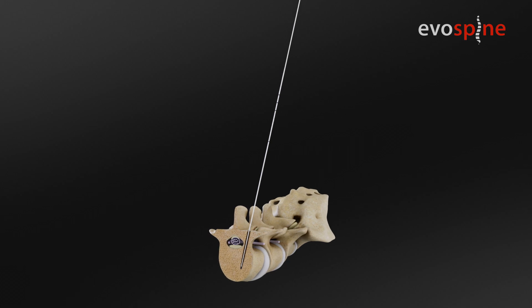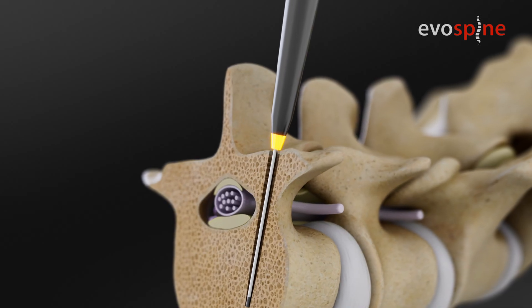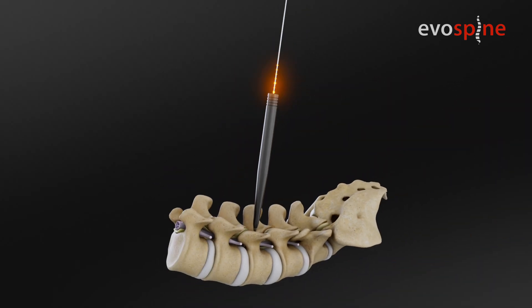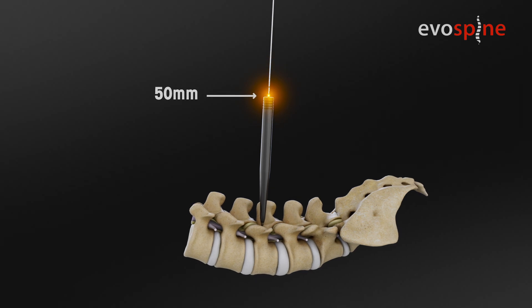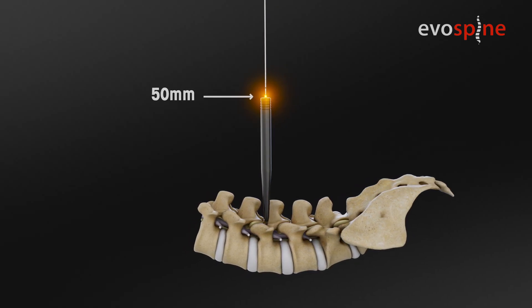The K wire remains inside. Place the dilator over the K wire and check that the dilator tip is right on the pedicle entrance. Read the laser mark on the K wire: three fat marks for 40, 50, and 60 mm from down to up. If the middle fat mark is at the dilator's edge, then a 50 mm screw is needed.